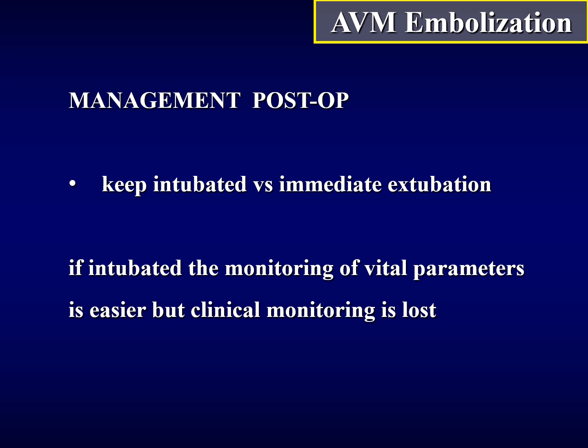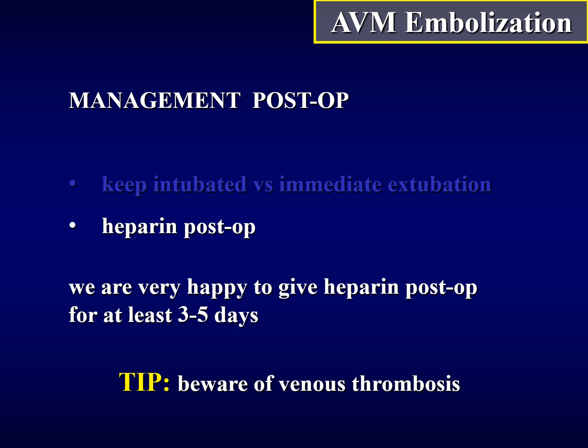So in most cases we prefer to extubate the patient immediately. Heparin post-op, I think it's very important. We are very happy to give heparin for at least 3-5 days, just because we are worried about venous thrombosis.